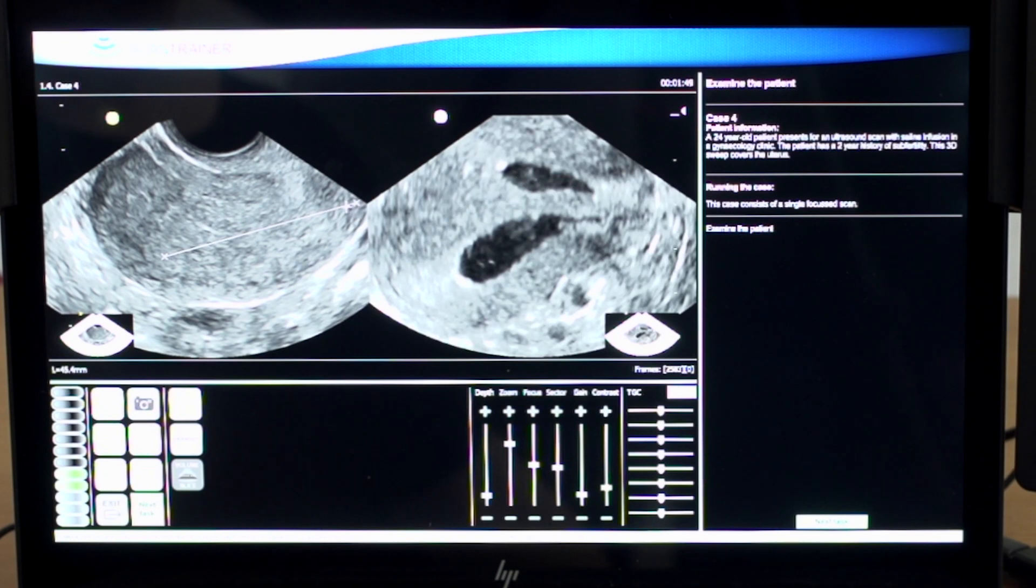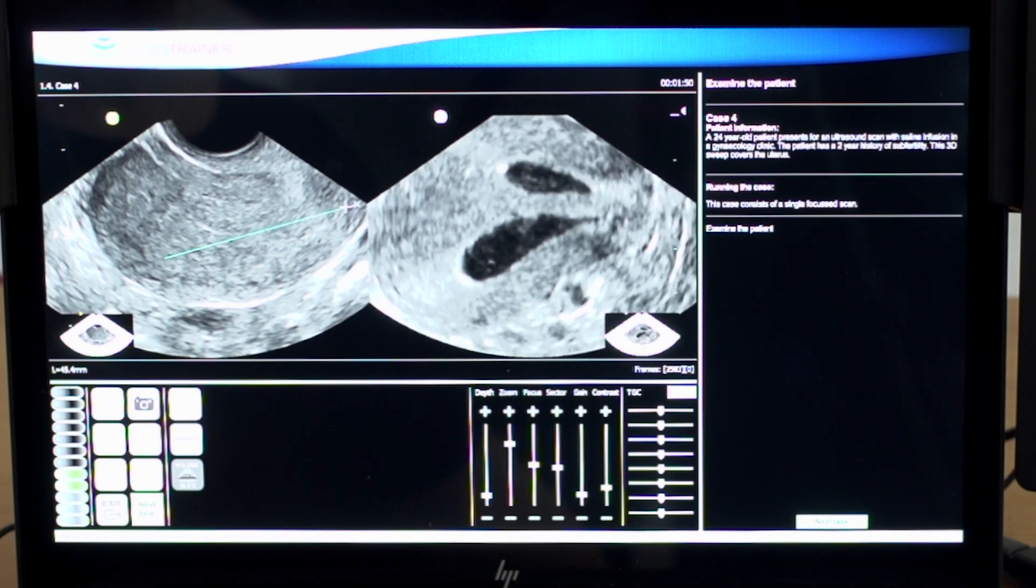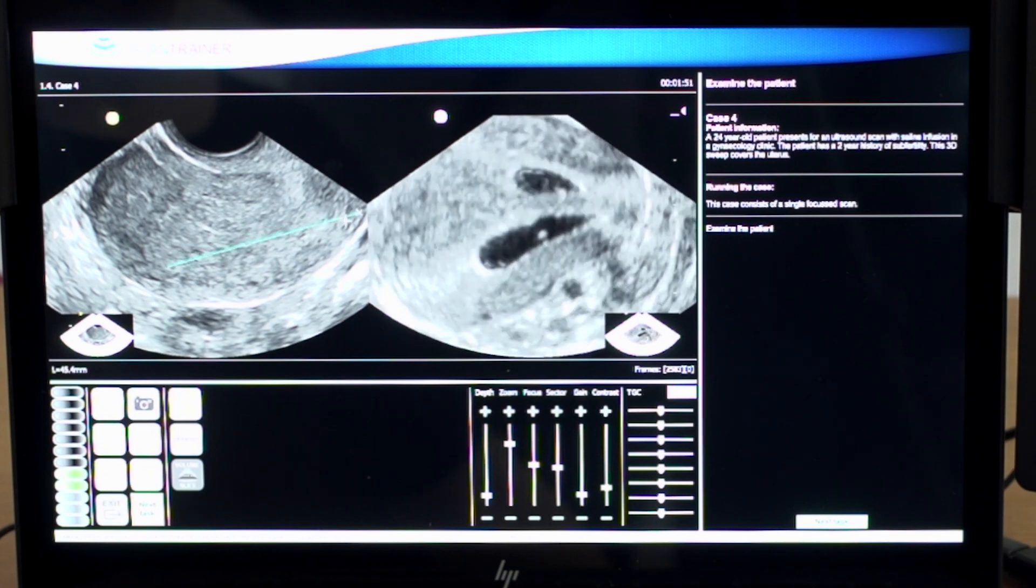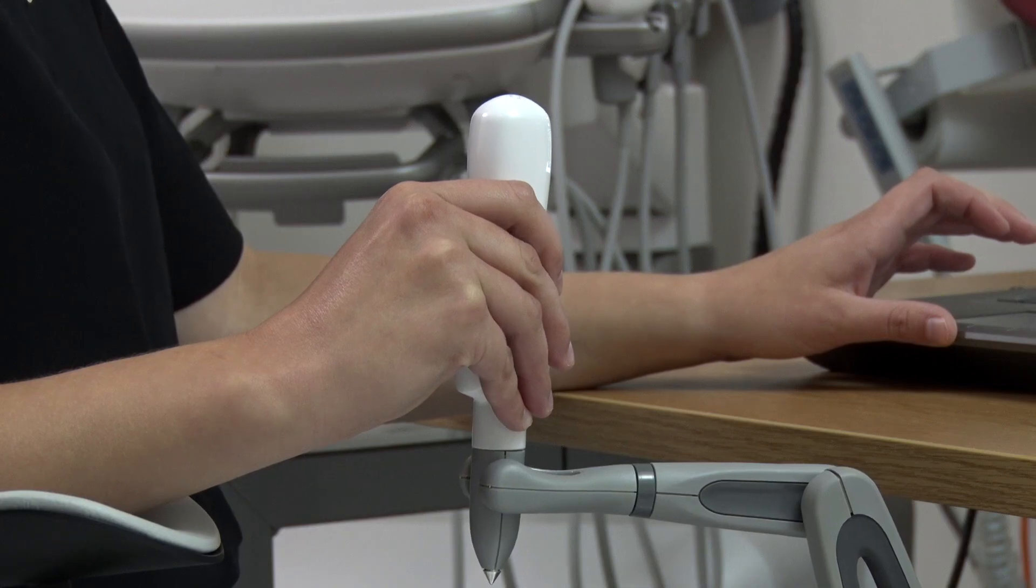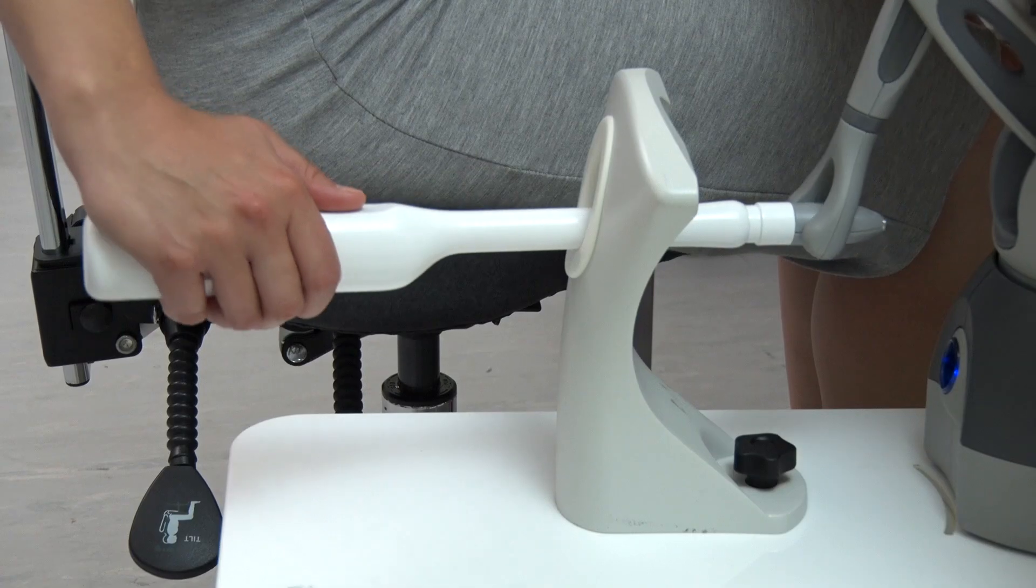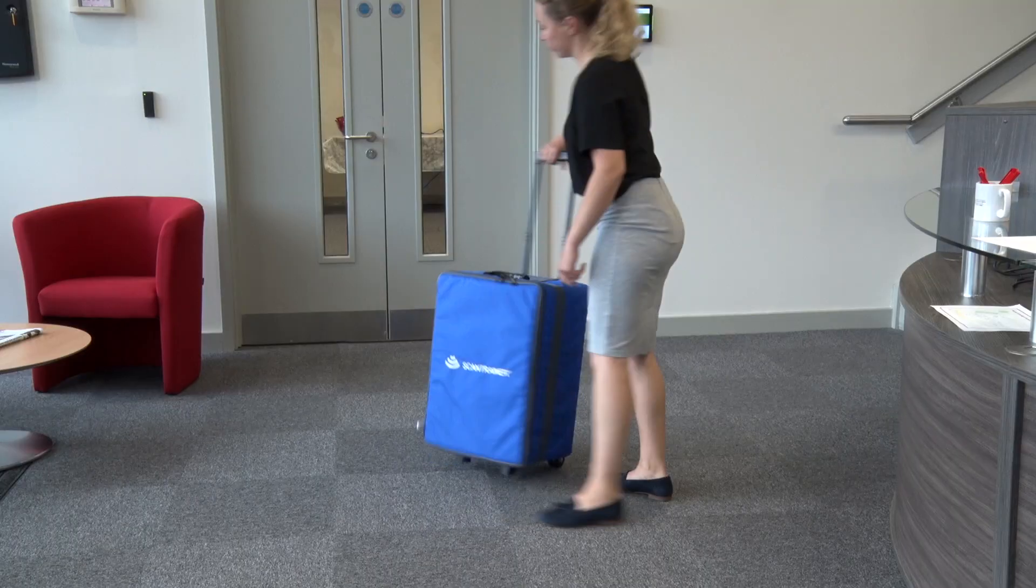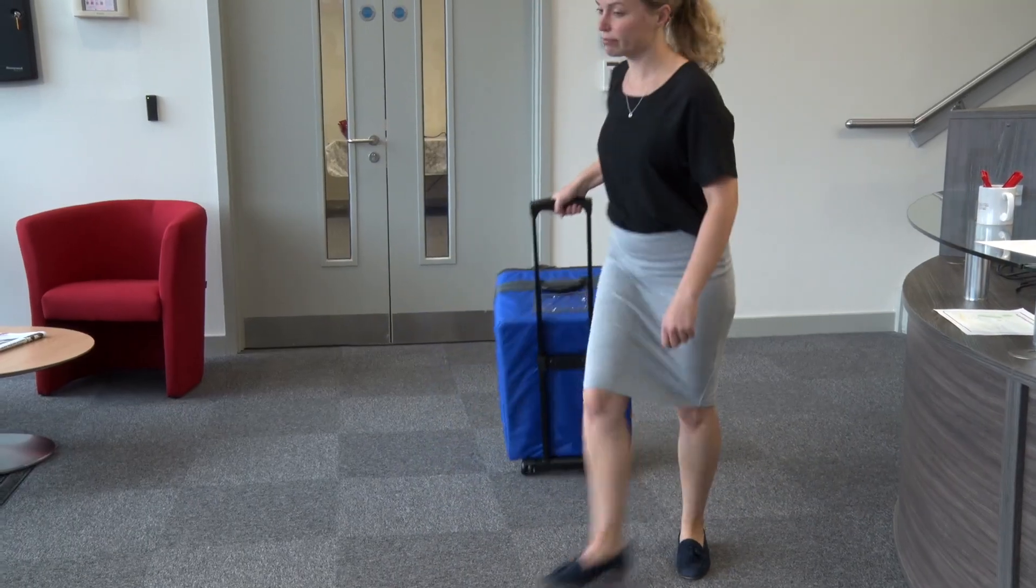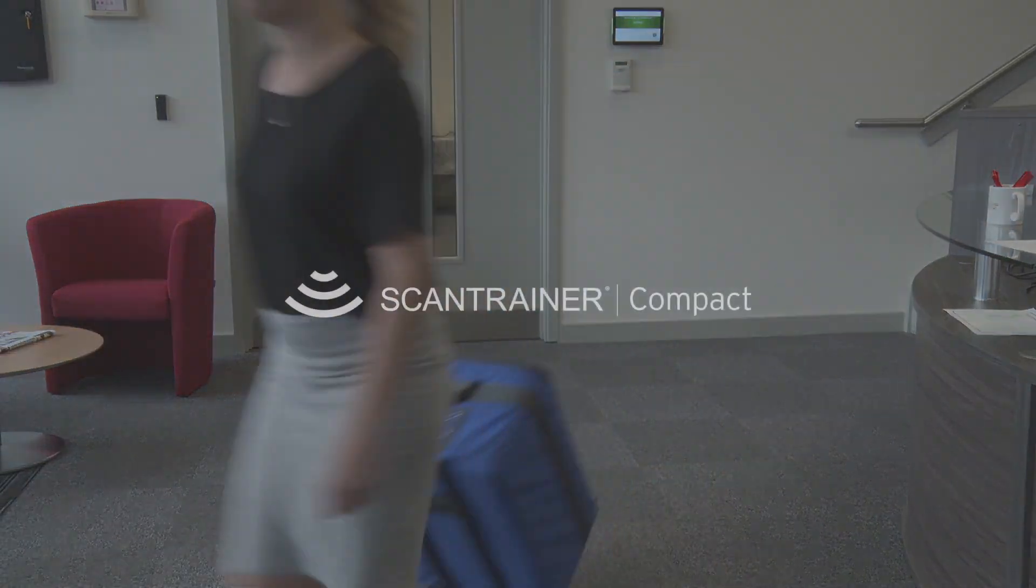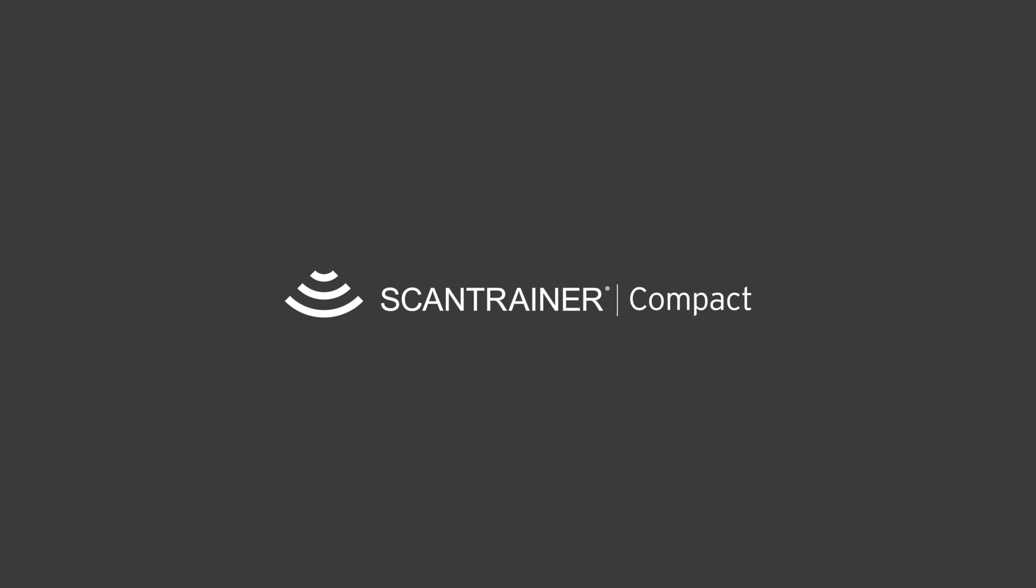ScanTrainer Compact allows for an easy transition between transabdominal and transvaginal scanning. It is highly portable, enabling training to take place anywhere. ScanTrainer Compact, extensive ultrasound training in one small package.